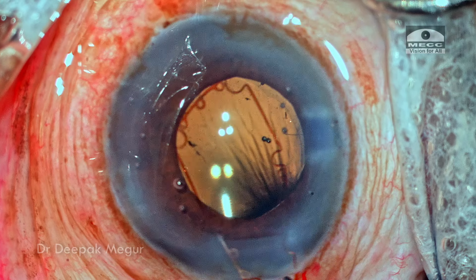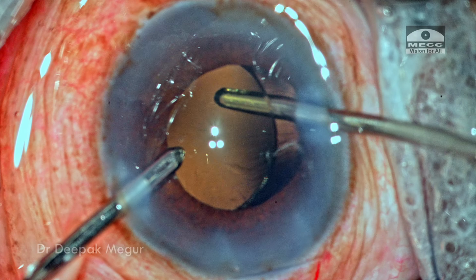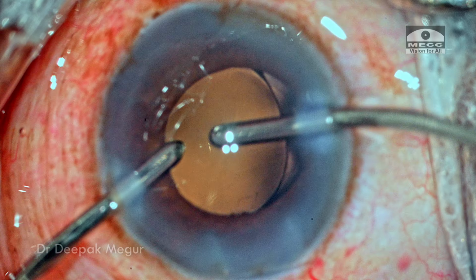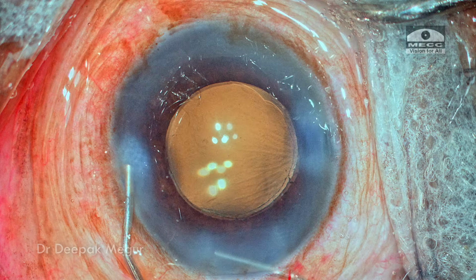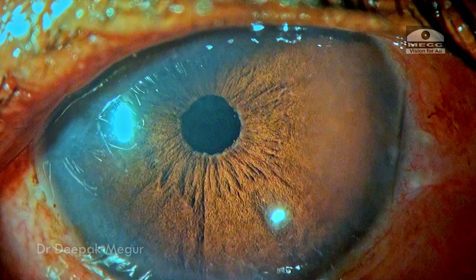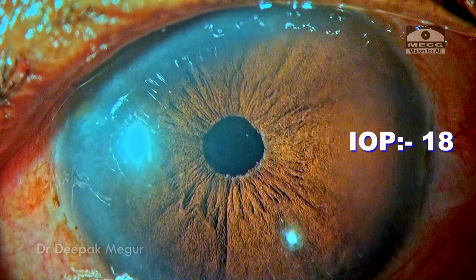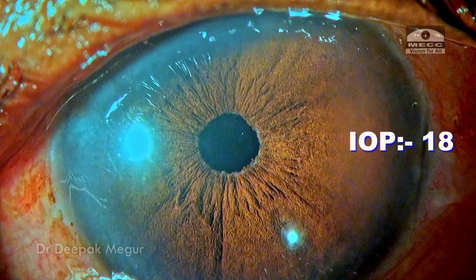frequently. The B-Hex ring is removed. The OVD both in front and back of the lens is aspirated out. And the wounds are hydrated. That's it, the case is done. So these are the post-op pictures and the patient is doing fine. The intraocular pressures on the first day were 18 and that's it.